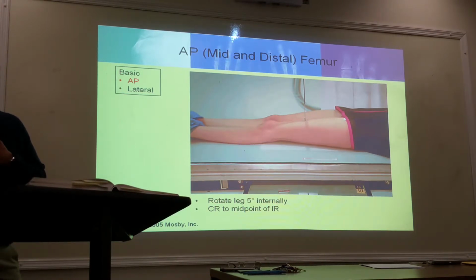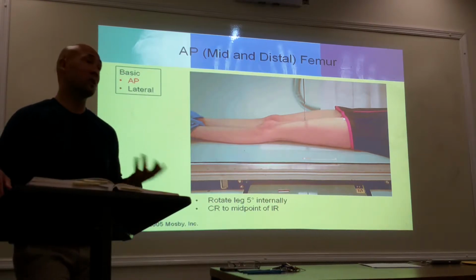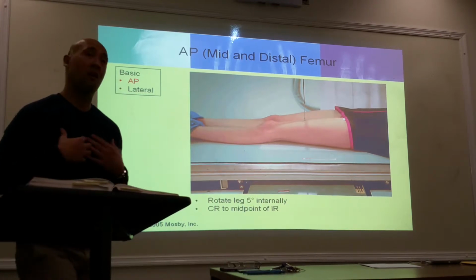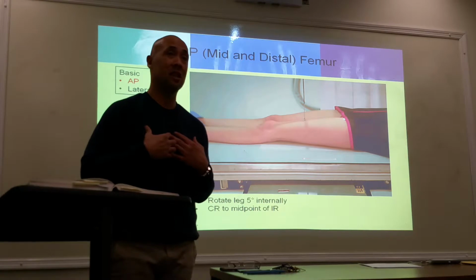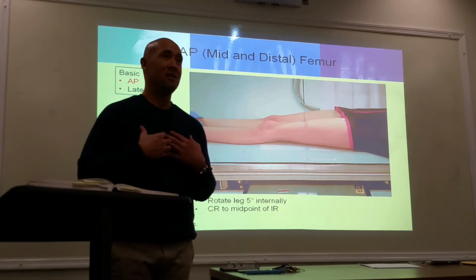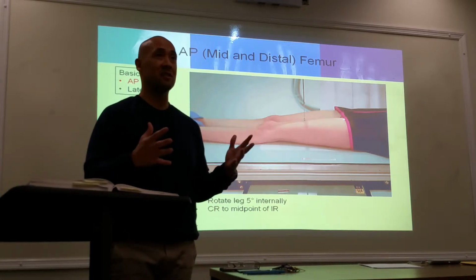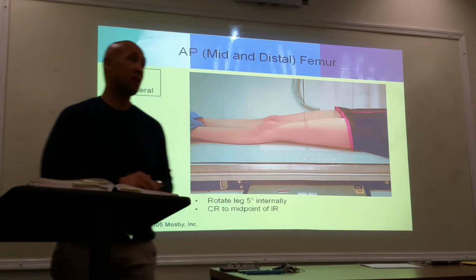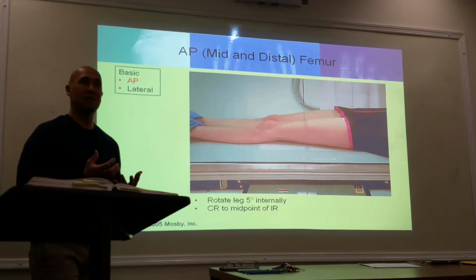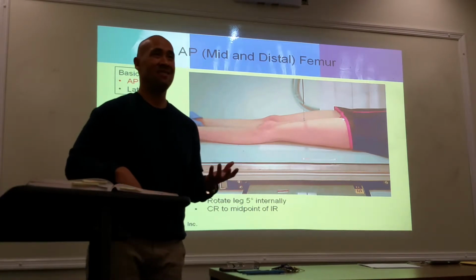Don't go by what I say, okay? Because once you start your clinical practice, the technologist will tell you exactly where to put those markers. Again, I'm old school and so is Ms. Smith, and we have a hard time understanding this concept of putting markers on the patient. It's hard for us to understand that. Because, you know, your body has all these different grooves and curves and things like that. We're used to just putting it on the image receptor, but the new text will tell you put it on the body. And I don't like that because then you end up having to put those markers in your pocket. It's a dirty thing for me.